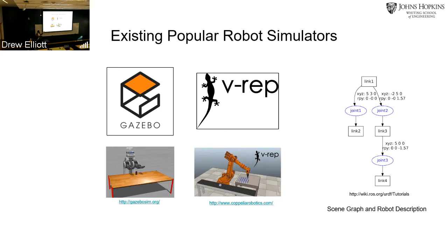While this tree-based hierarchy makes sense for serial robots and for the scene graph, it creates big problems for simulating surgical robots. Why? Because surgical robots often have kinematic loops, and that's how you get constrained actuation. Other than that, these simulators lack software support. These simulators have a retrofitted communication interface and many drawbacks, but I don't want to take away anything from these simulators as they are much bigger and better than AMBF in almost everything. But I might be picking at them a little bit throughout this presentation, with no hard feelings.